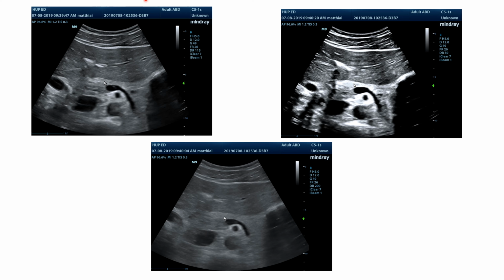So far, this dynamic range business seems to be kind of a waste. The machine factory settings have an appropriate dynamic range. When we turn it down or we turn it up, it just makes the image look bad. It makes it hard for us to identify the structures we want to see. So why would we ever even want to learn about dynamic range?